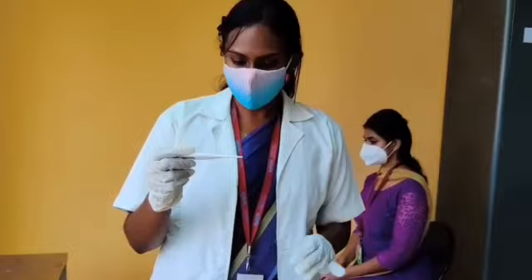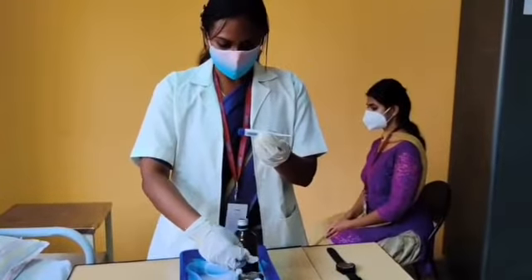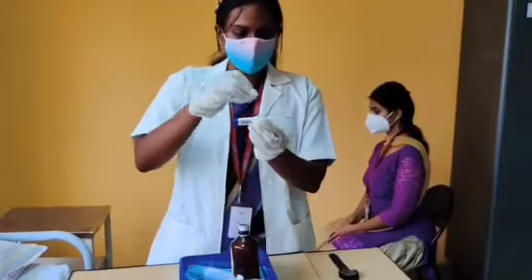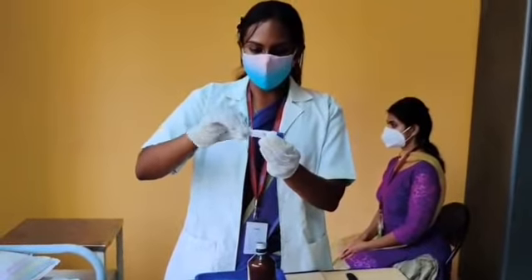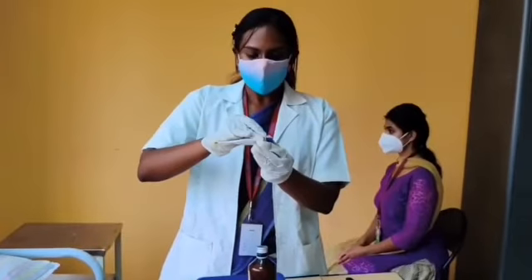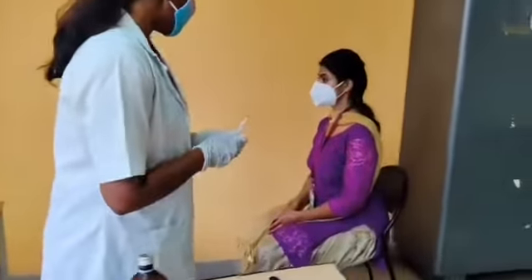Checking the temperature with a digital thermometer. First, we will take the digital thermometer, which is nowadays commonly used. We will wipe the digital thermometer with spirit-soaked cotton from the bud to stem — from less contaminated to the more contaminated region.